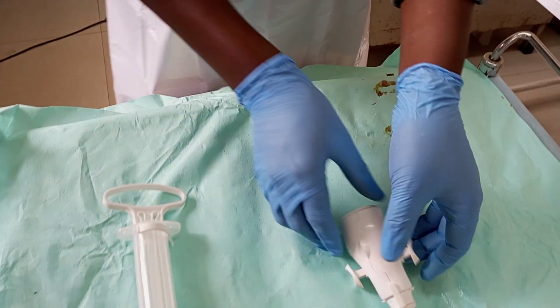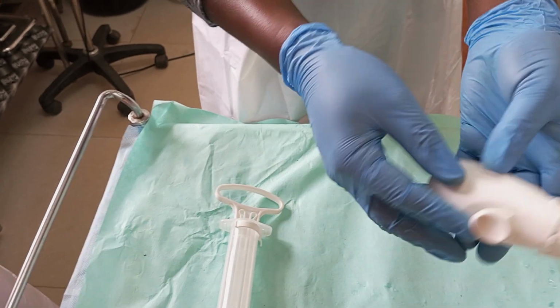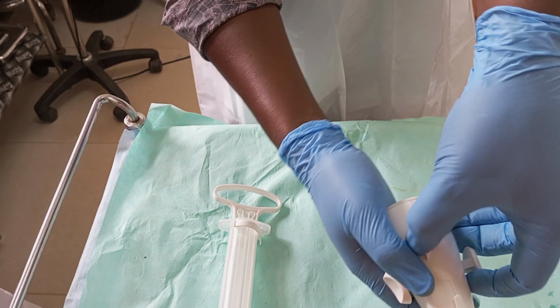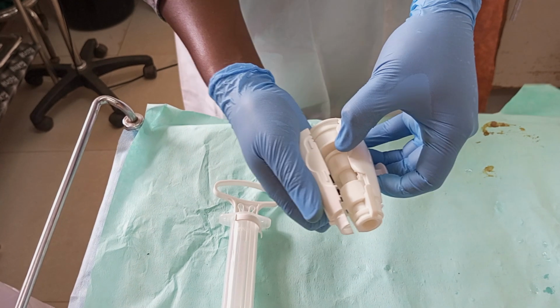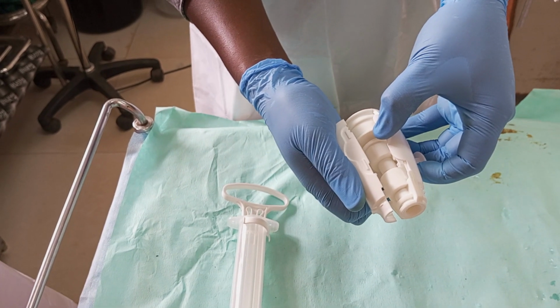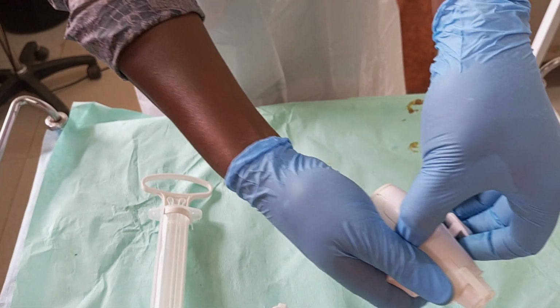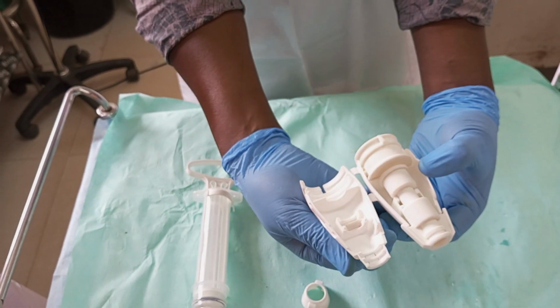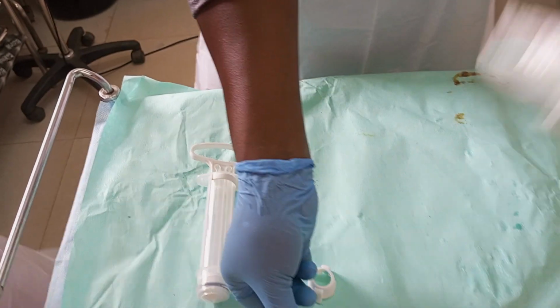Thereafter, you can come and flip this out. There's a provision here where you can put your thumb. Hold it firmly. You put your thumb, right? Like you're opening up a groundnut shell. Hold it there. Open. You have opened the valve. Next, you can remove the valve liner.